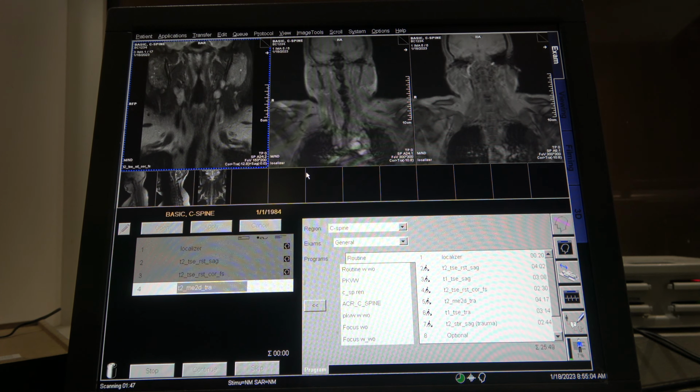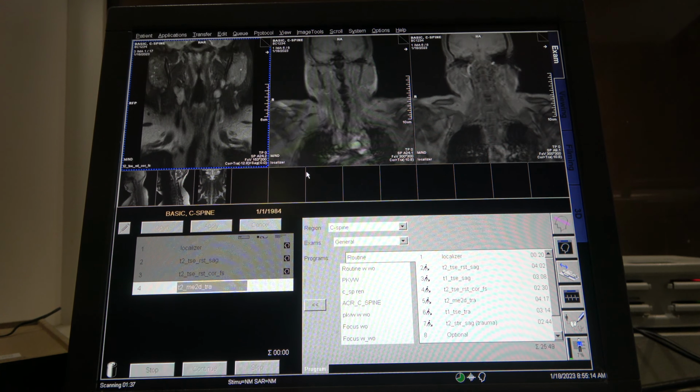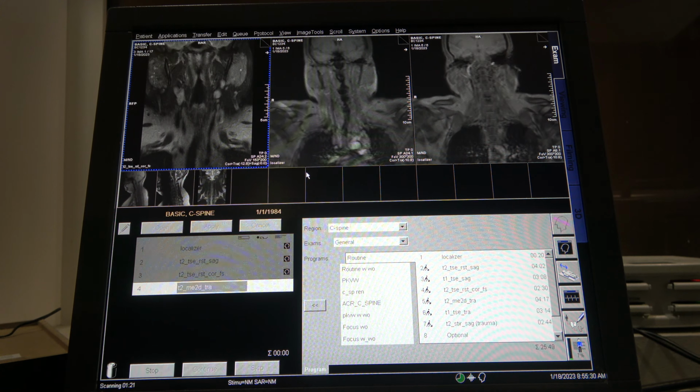Now, sometimes it's a great idea to ask your patient if they want to be bothered with time remaining. Some patients want to know how much longer. Without them asking you, ask them up front. Let them know: would you like me to tell you every time a sequence is about to start, or would you like me to tell you when you're halfway there?